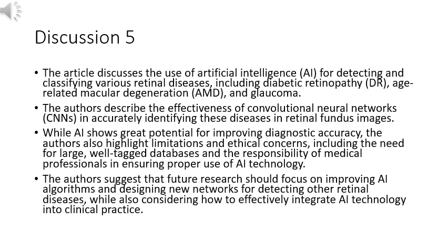It would also be desirable for further investigations to evaluate AI-assisted interpretation in other non-retinal specialist personnel such as general ophthalmologists or primary care physicians. Deep learning opens an exciting chapter for the future. AI algorithms seem to be reliable for determining whether or not an image is CFP. Those algorithms are useful for evaluating the quality of the retinal fundus image and also for determining DR, AMD, and suspected glaucoma. As discussed earlier, the next steps will be to continue feeding the beast, providing more and more classified images to improve accuracy and creating new CNNs for other diseases.